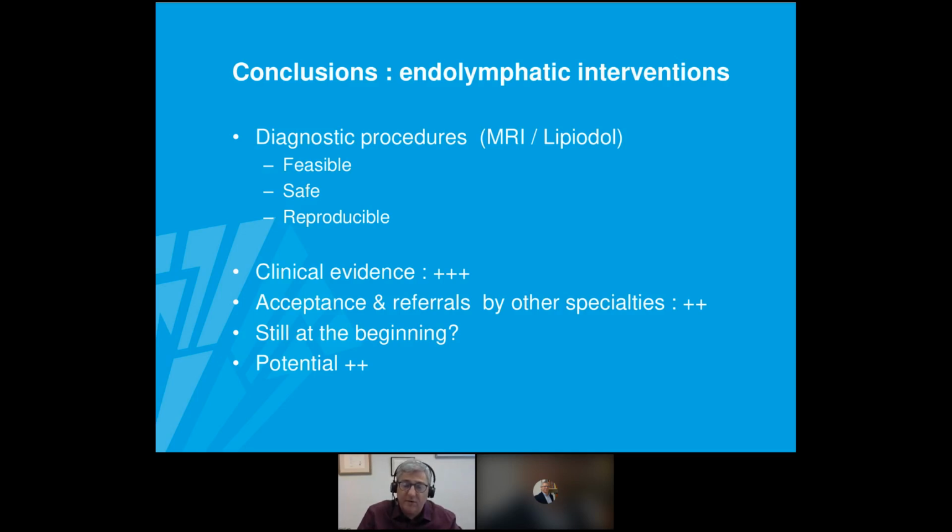Over that coronary wire, because they are much more rigid than the micro guide wires which you use in combination with microcatheters, at 0.014 or 0.018, you can gently introduce a microcatheter without a sheath. So immediately a microcatheter over that 0.014 wire. That's the technique. Thank you very much, Geert.